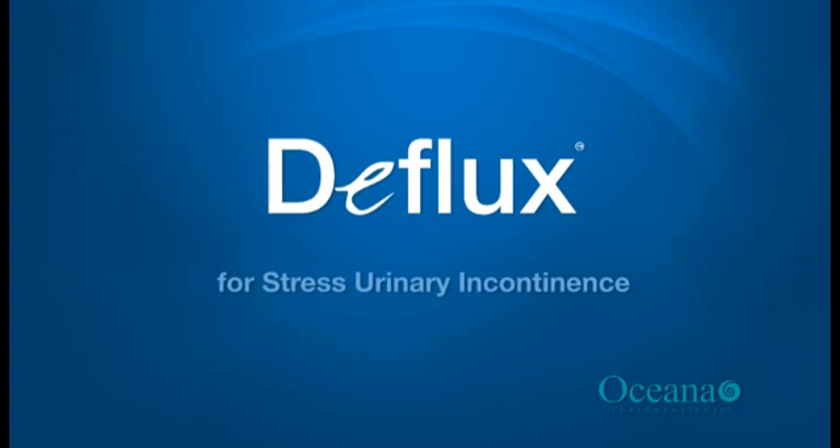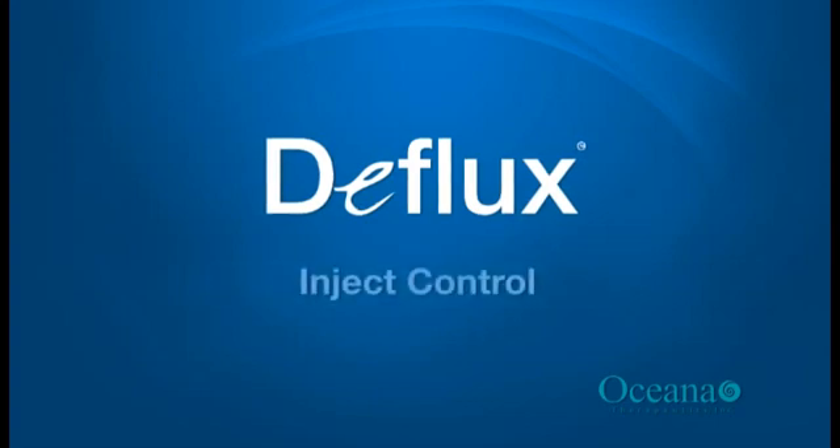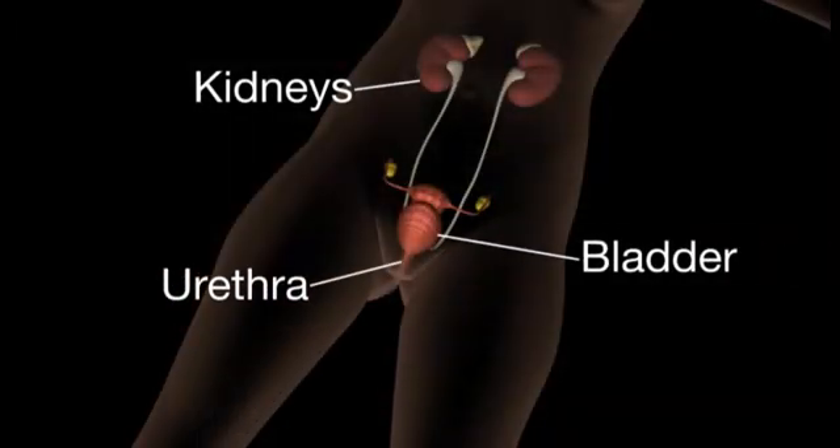Welcome to this short animation which demonstrates how Deflux is used to help relieve the symptoms of stress urinary incontinence. Here we see an illustration of some of the key parts of the urinary system: the kidneys, the bladder, and the urethra.